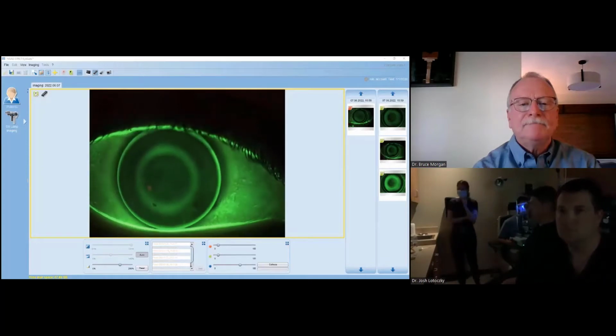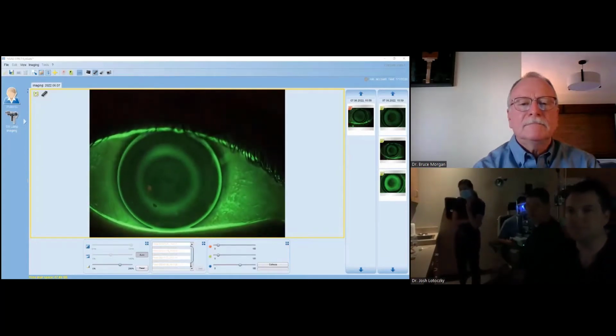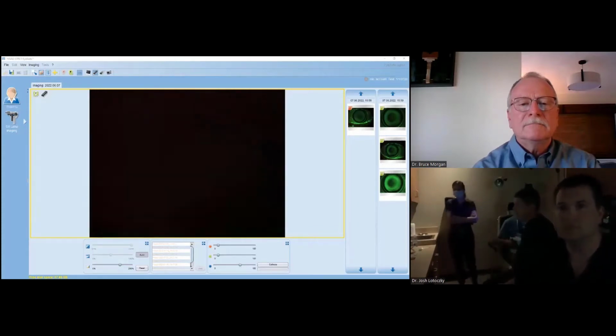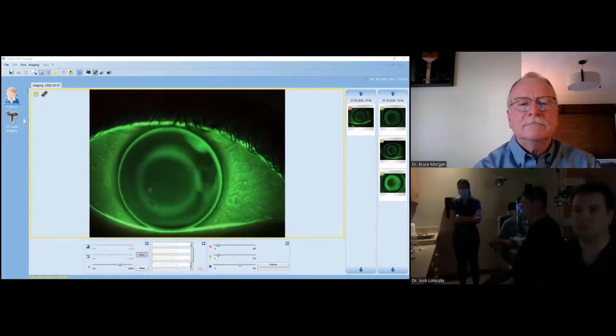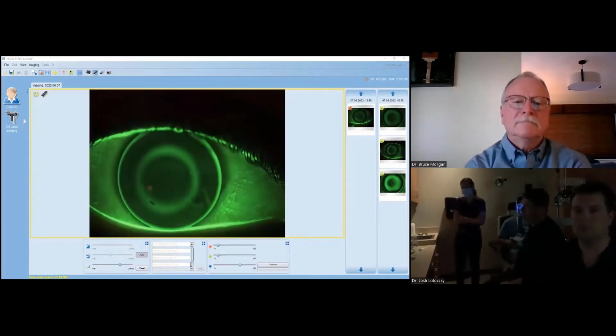It's maybe slightly low, but we know when the patient closes their eyes, they're probably going to develop reflex and the lid's going to probably roll up. So oftentimes what I'll have the patient do is close their eyes for about 10 seconds. And then when they open, I want to watch where the lens comes from. So go ahead and open. You can see that it came from the top. It was no longer down quite as low as it is right here.